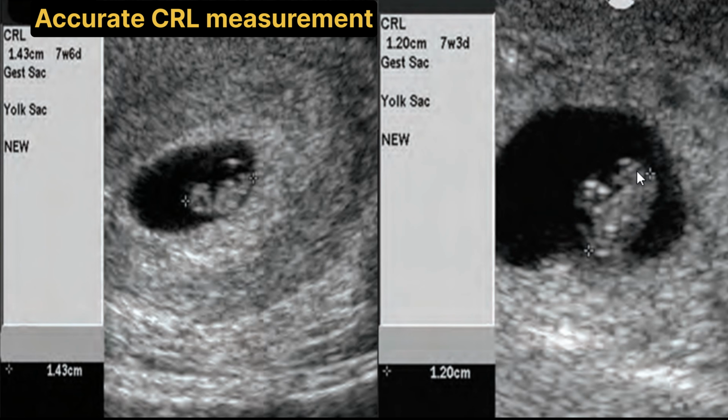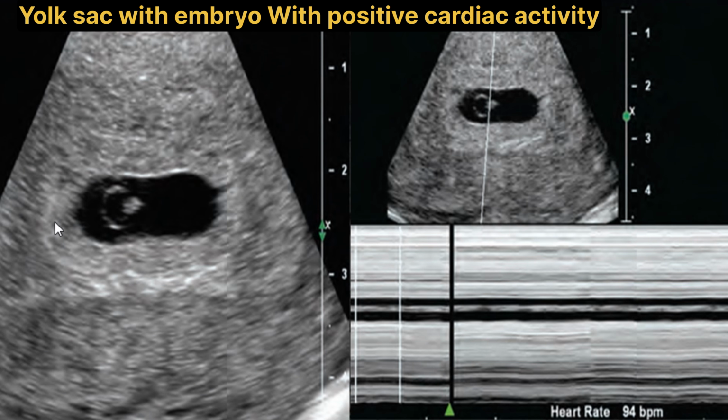And here we can see the longitudinal transvaginal image of the same embryo, and it shows the measurement of the crown rump length after the scan plane has been adjusted to exclude the yolk sac, and the resultant crown rump length measurement is about 1.20 centimeter, corresponding to 7 weeks and 3 days. This is 3 days less than the crown rump length obtained when the yolk sac was incorrectly included in the measurement. Now we are going to discuss the small embryo.